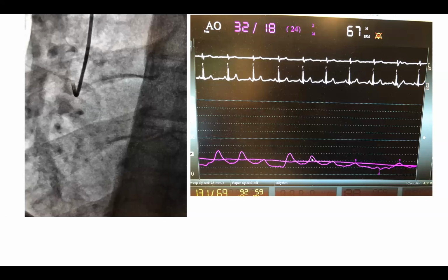So the pressure is damped. That means that this catheter is wedging the coronary artery. It could be that you're engaging a very small or diseased ostial RCA. That's one thought. But the most common thought, whenever the catheter is looking like this, looking upward and a little anterior, meaning it's not spread all the way to the right, your immediate thought is, yes, you're in the conus branch.